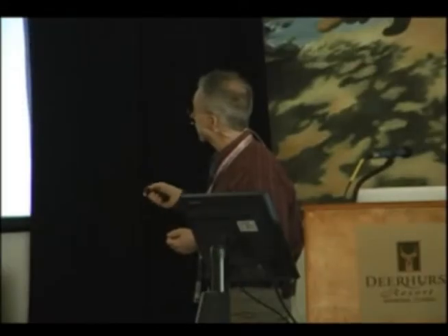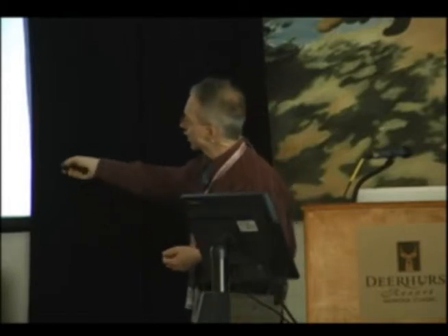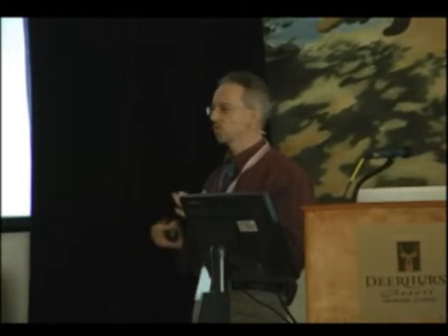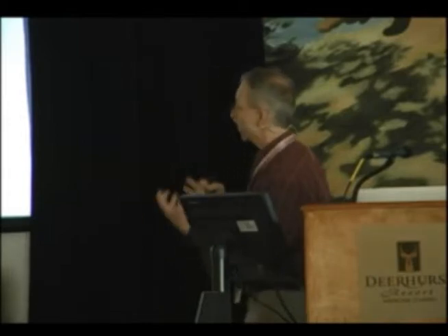So this coil here is sensitive to sodium. Sodium-23 is the native kind of sodium in your body. It's not radioactive. You don't have to inject anything. It's just straight up sodium. So this is a sodium image through the leg. We know from various diseases that sodium will actually increase in concentration. We're working on right now looking at intra versus extracellular sodium and measuring those things as well. So we can bring that in.